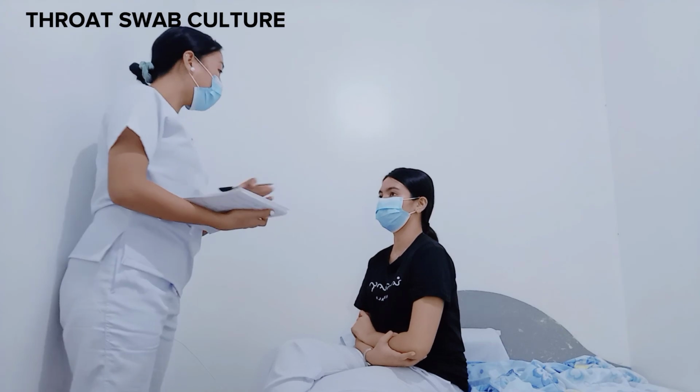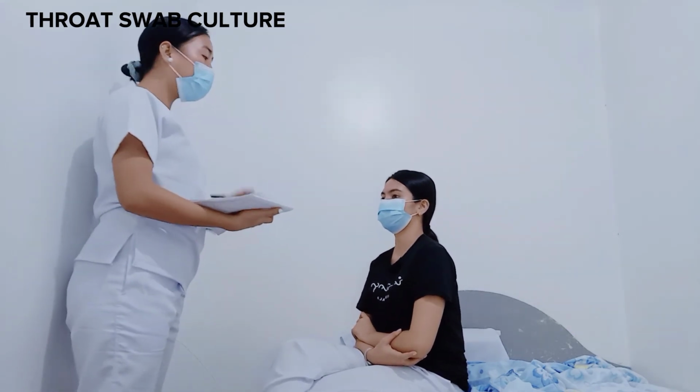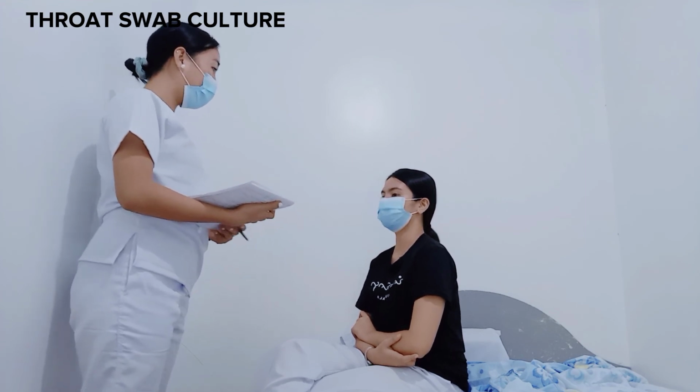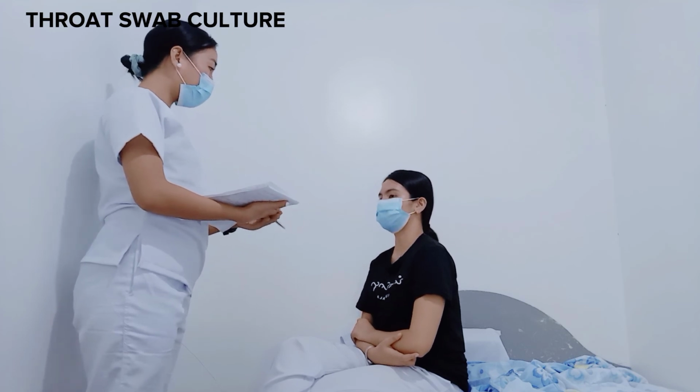Good day, ma'am. I am Camille Dungpa, your student nurse for today. Good day. Today, ma'am, I will be conducting a throat swab culture. Is that okay with you, ma'am? Yes. Okay. I have a few questions, ma'am. Is that okay with you?